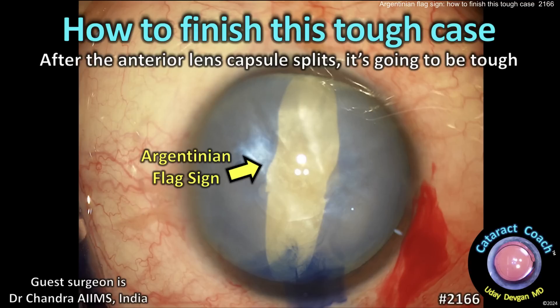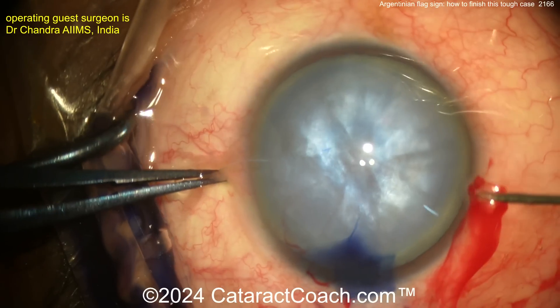CataractCoach.com. How to finish this tough case. After the anterior lens capsule splits, it's going to be tough. There's that Argentinian flag sign. Let's cut right to it.